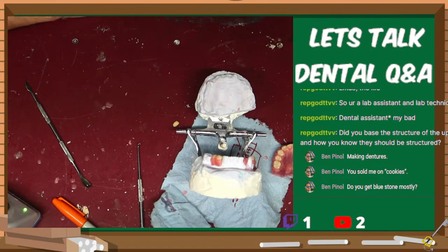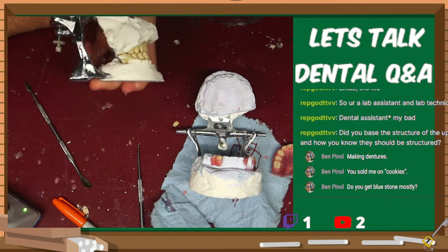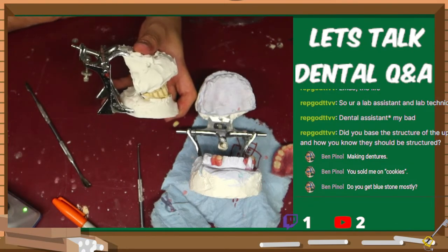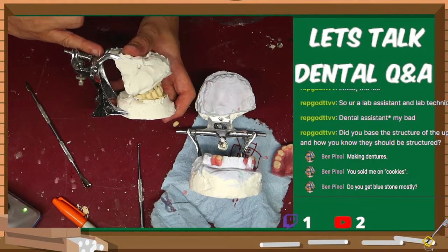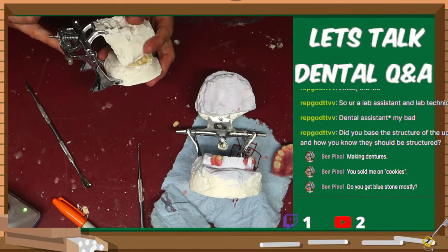So in a lot of cases, and this is another case that I have here, you are going to have a device like this, and there's a bunch of fancy ones. This one is called an articulator. This one is pretty basic for the most part. It's just an upper jaw, essentially, a lower jaw, and the ability for it to open and close.